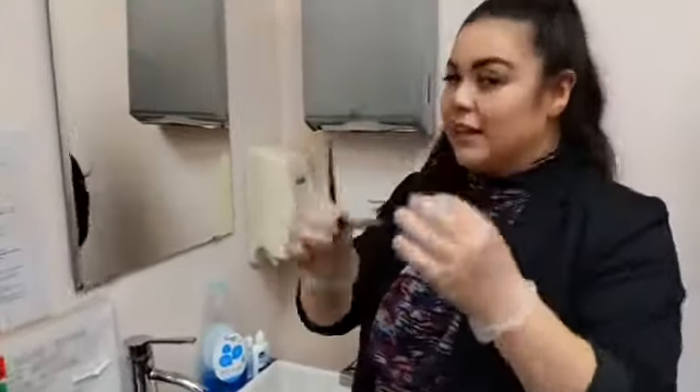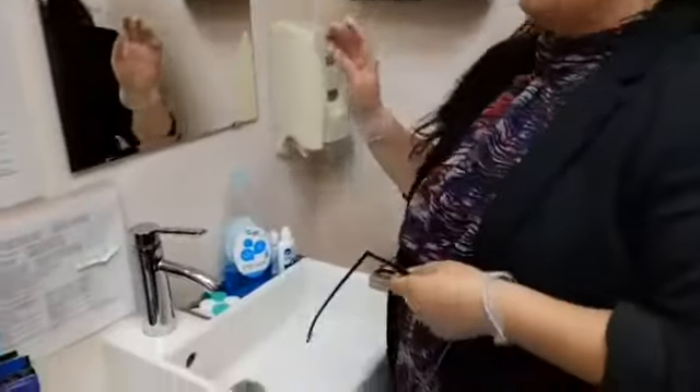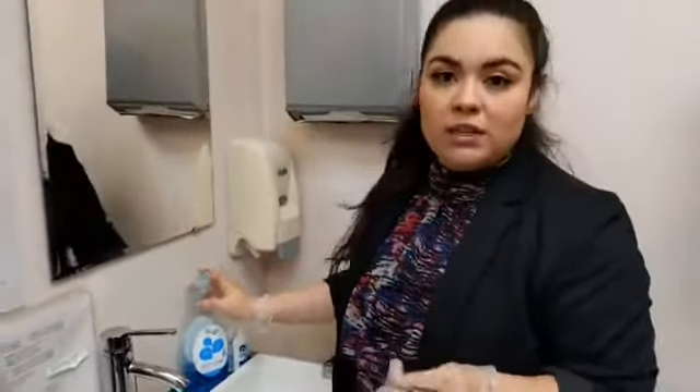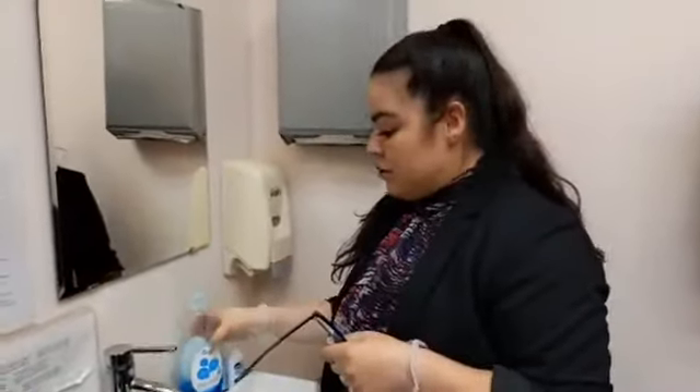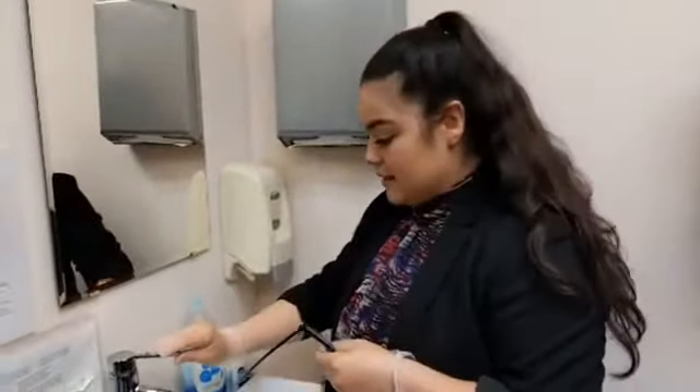Today we're going to demonstrate how to clean your glasses, so come with me. The soap we recommend the most is dish soap. Let's start cleaning my glasses today.